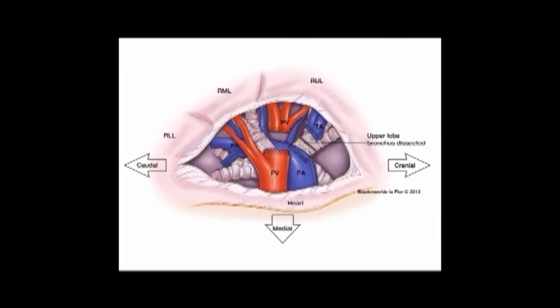Now you have divided all of your hilar structures going to the right upper lobe — the bronchus, the artery, and the vein. Now that these have all been divided, all that remains is the fissure. The fissure is stapled from the utility port beginning anteriorly towards the posterior area, angling upwards to preserve the superior segment of the right lower lobe. Once the fissure has been divided, the specimen is placed into an endocatch bag and removed through the utility port.